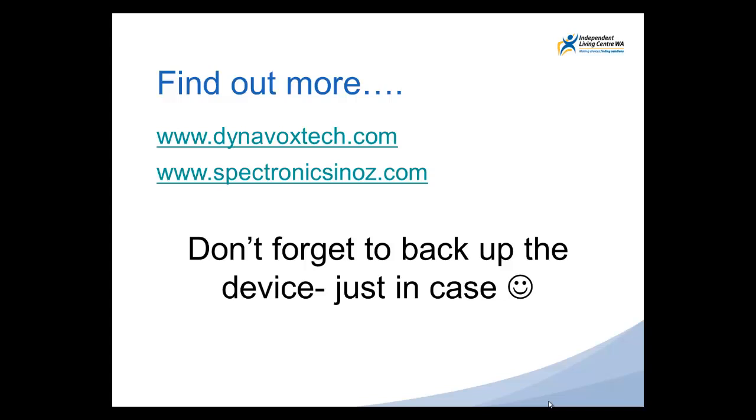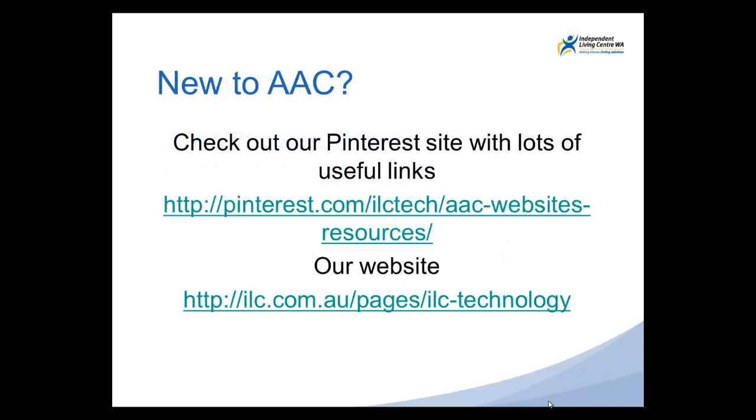It's really important, just as a reminder, that it should be someone's job to back up the device. If you're spending time customizing the vocabulary, you really want to make sure someone's backing it up. And if you need information about that, please don't hesitate to contact us.